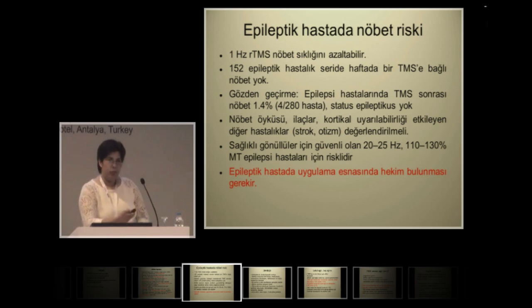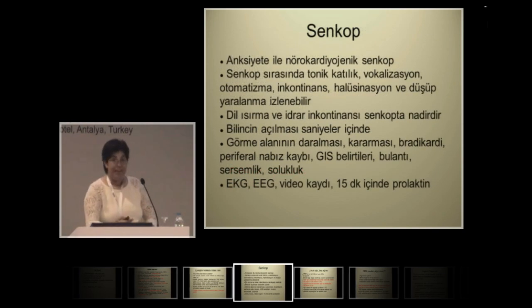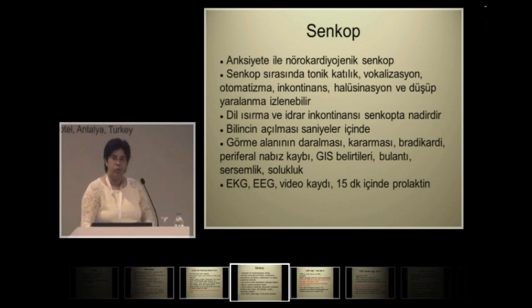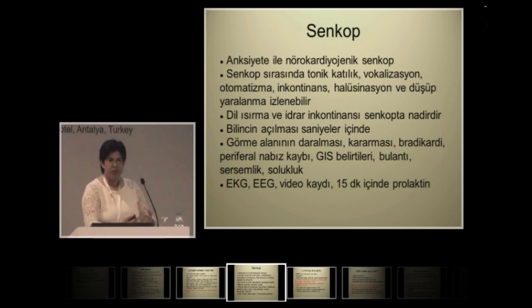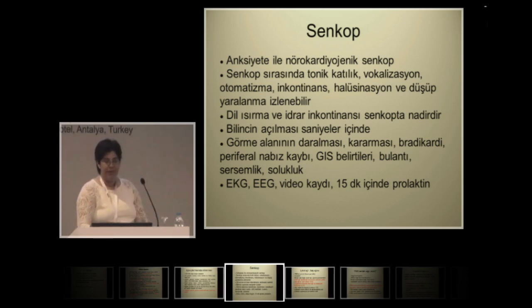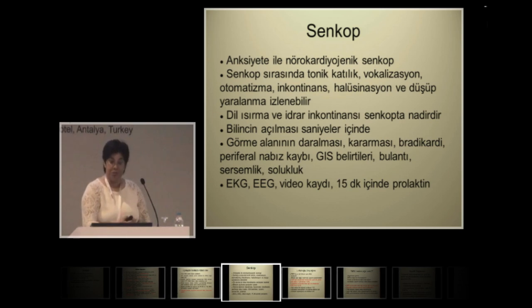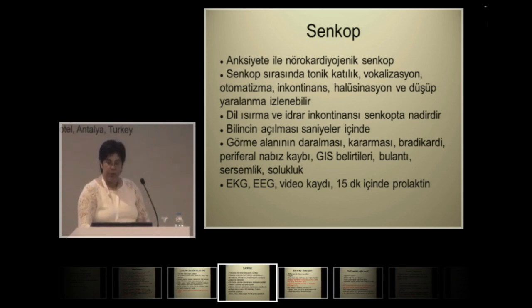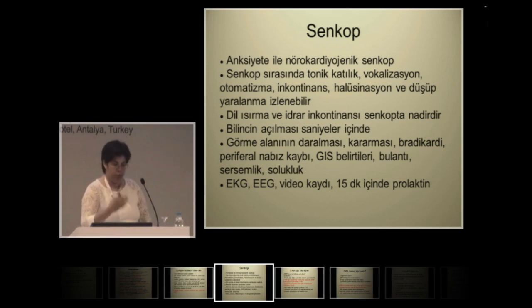And it may be high risk for patients if you use 20 to 25 Hertz at 110 to 130%. What we most frequently observe in terms of scary side effects is syncope. It's like the normal syncope. Patients are really very anxious because it's like sitting in the dentist chair. Vocalization, automatism, incontinence, sometimes there may be hallucinations, the patient may fall and injure himself. I've seen this in 3 or 4 patients.